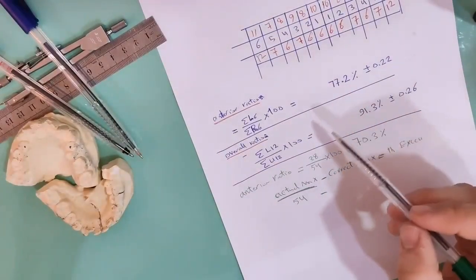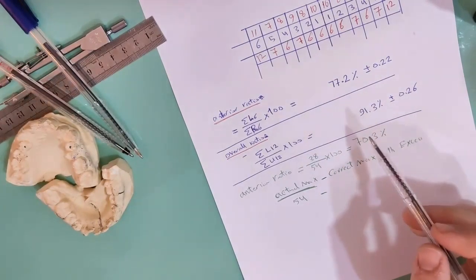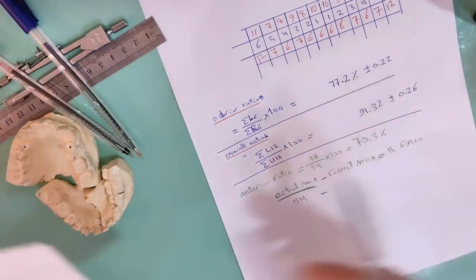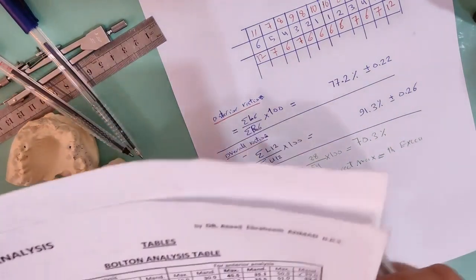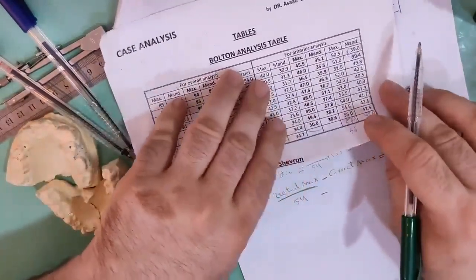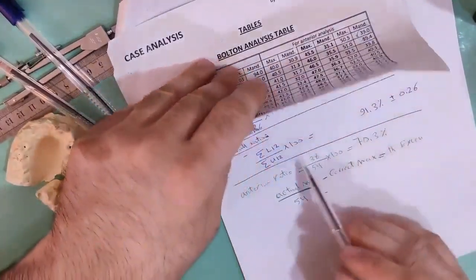When we know the problem is in the maxilla, we assume the mandible is in the correct position.